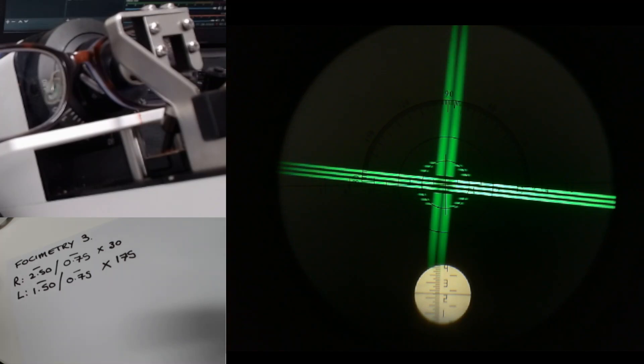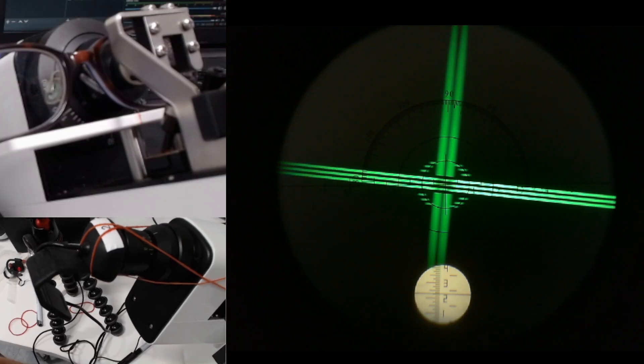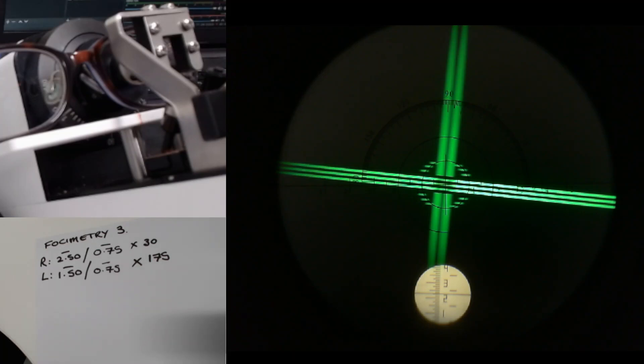Usually when you look down the focimeter, you get a slightly clearer image than this — the webcam works pretty well. I can show you the tech: I've just got a webcam held on with elastic bands, so it's very low tech but it does the job quite nicely. The human eye works better than a webcam — I'm sure you all appreciate that.